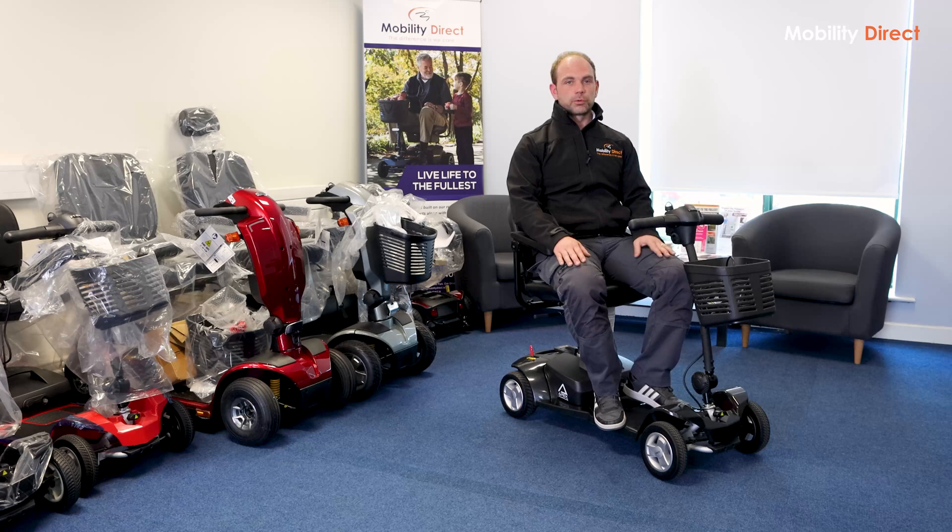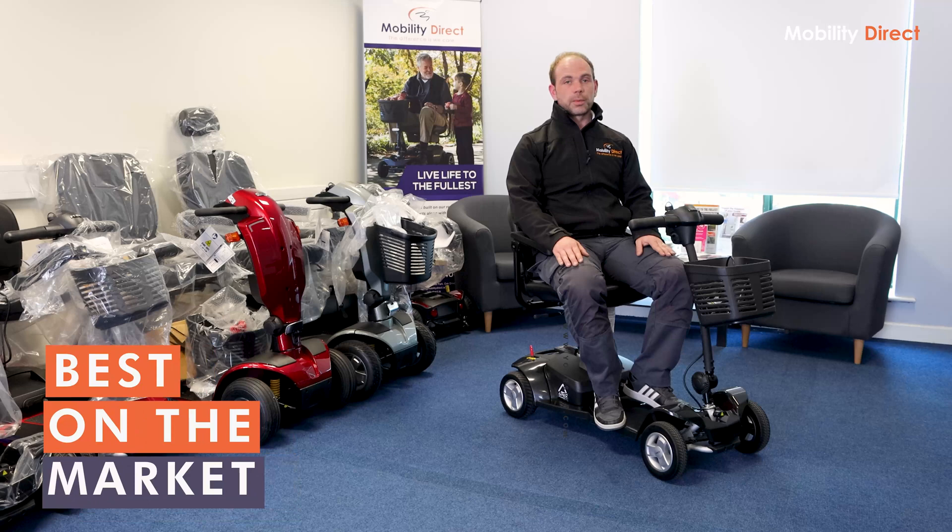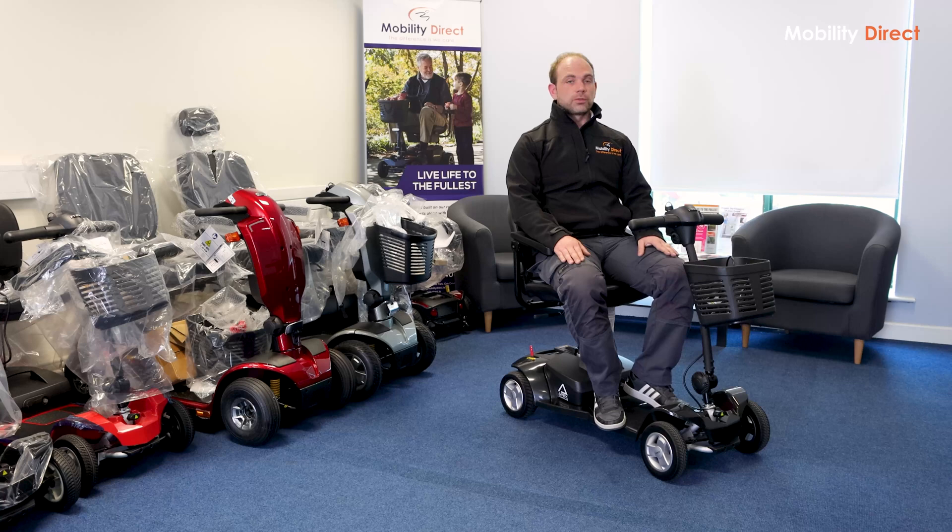If, on the other hand, you can manage the weight of the other scooters — the Apex Light or something similar — then there isn't really much point in considering this one, as essentially you'd be paying a premium for nothing. But weight-wise, it is one of the best on the market at the moment. So if you're going to be transporting the scooter on a regular basis and you struggle with the weight of some of the other models, then this is definitely one worth considering.